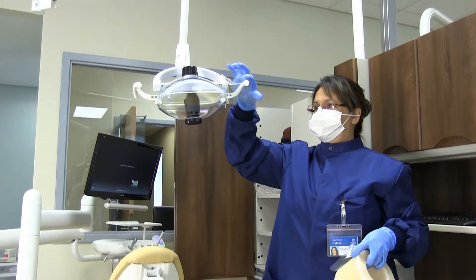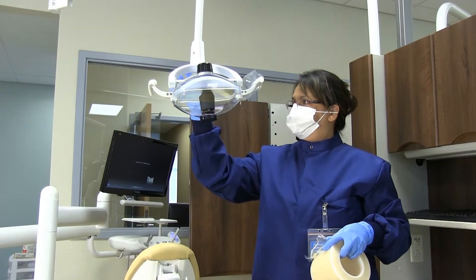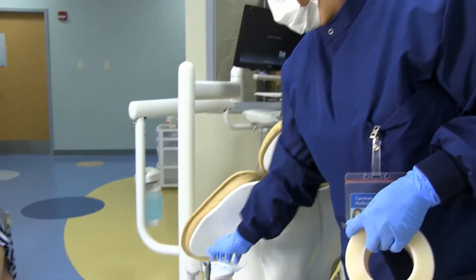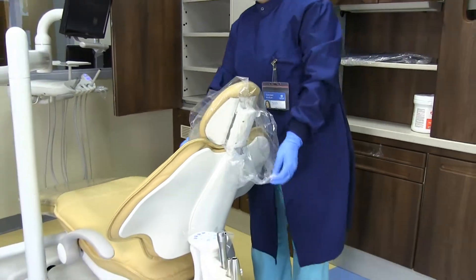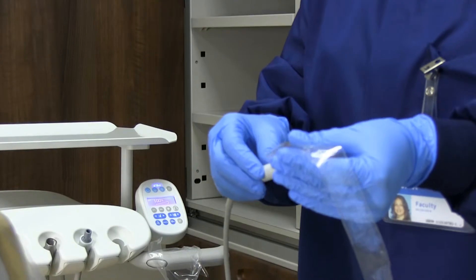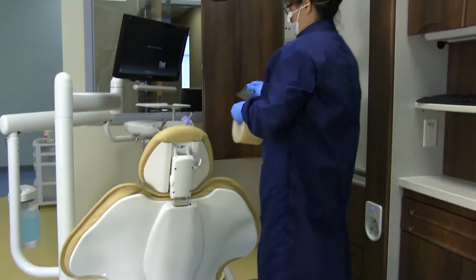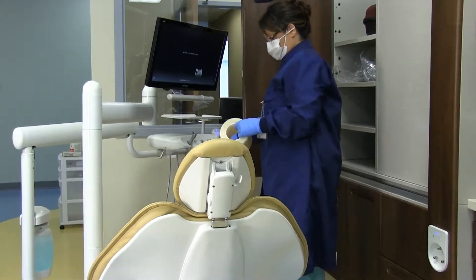Next you will place barriers. Barriers should be placed on any surfaces known or likely to become contaminated by touching, droplet, or splatter, or by transfer from contaminated items. Place barriers on the following: light handles and light switches, chair headrest, chair switches, front delivery system and attachments, a handpiece if you have one, an ultrasonic, intraoral camera arms on the delivery system hoses, tubes and cords, saliva ejector, high speed evacuation hose, air water syringe, and the delivery system arms.